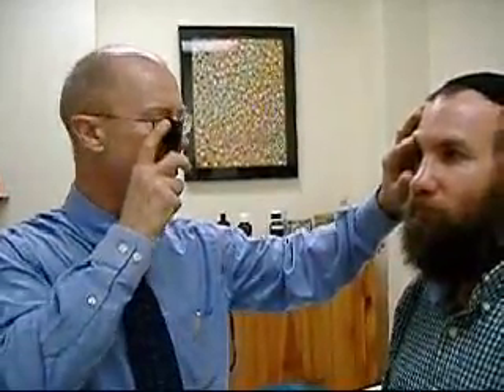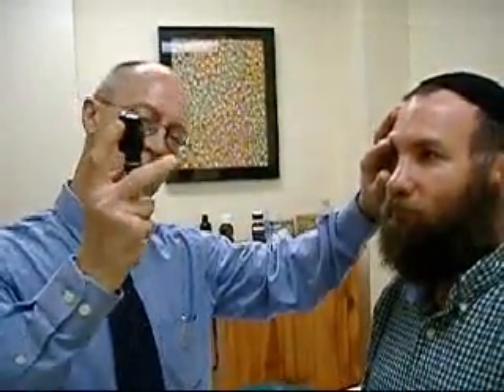I'll put my hand up here not to hold his eye open — you cannot do that — but to keep me from bumping into his head, which I'm sure he would appreciate. If you look straight ahead at him, I go like so with my finger right here on the ophthalmoscope so that this finger can come in contact with my thumb so I don't poke him in the eye.